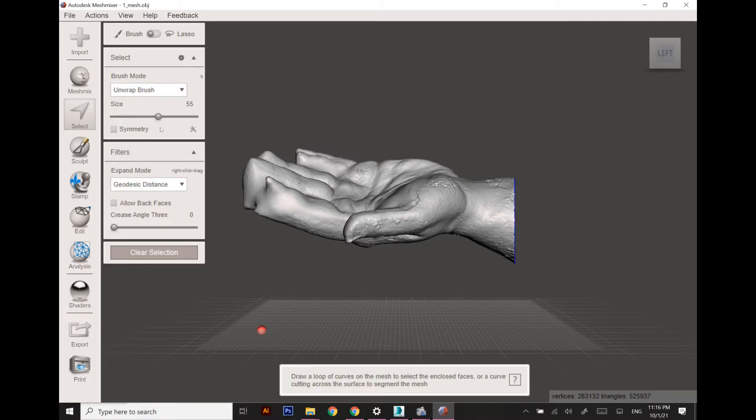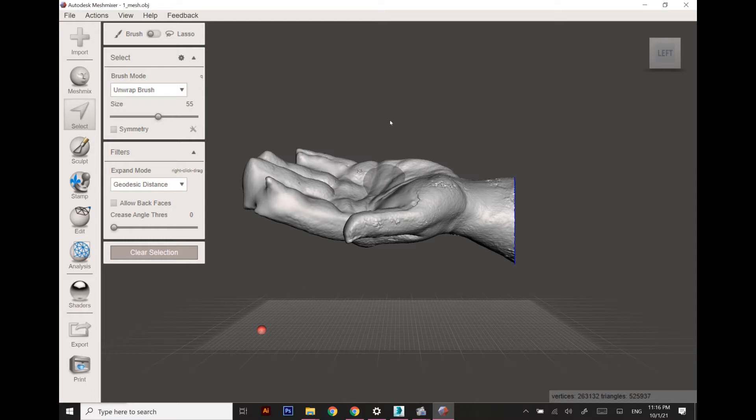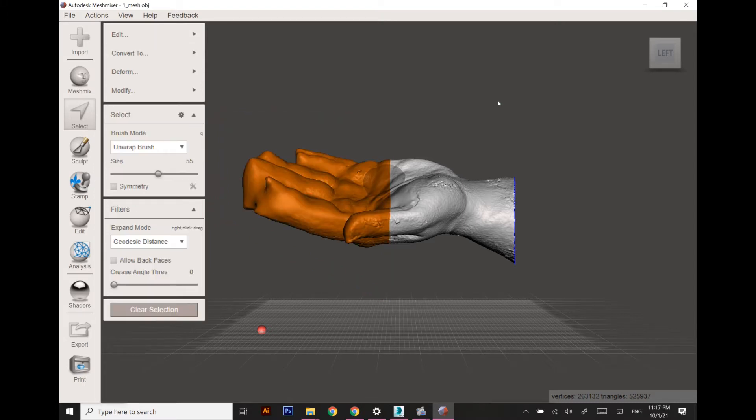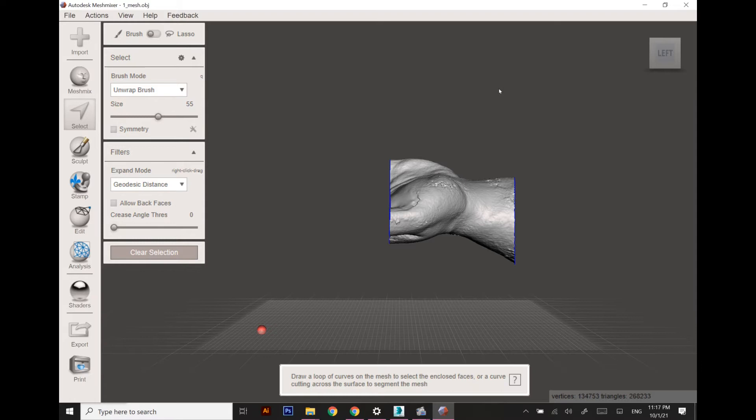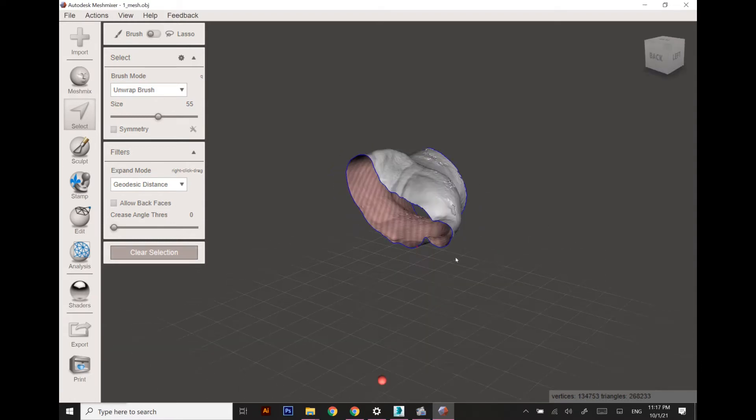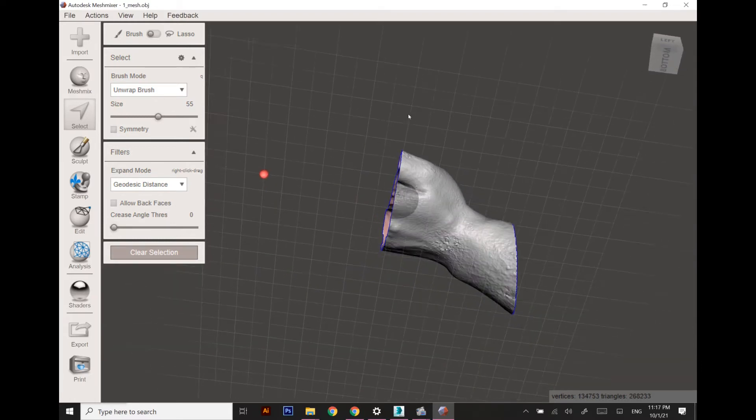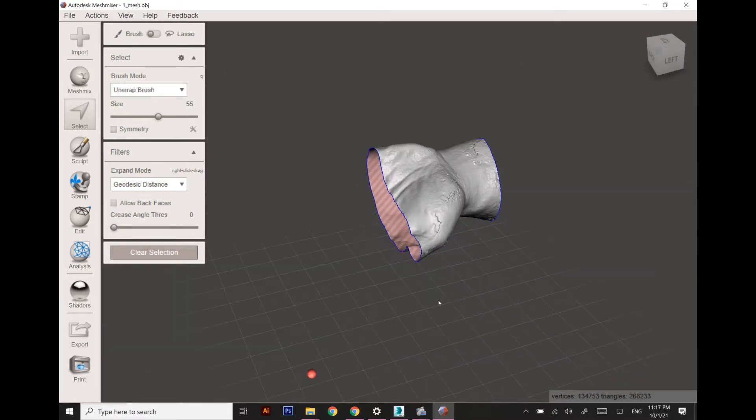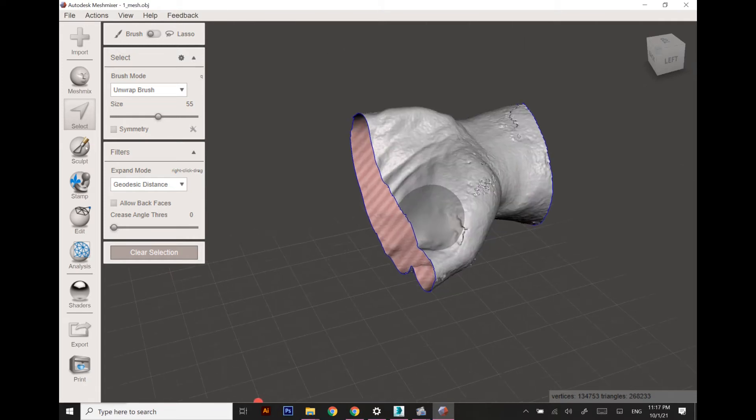Once the areas are selected, hit delete to remove the unnecessary areas. As you can see here, these are the required areas.